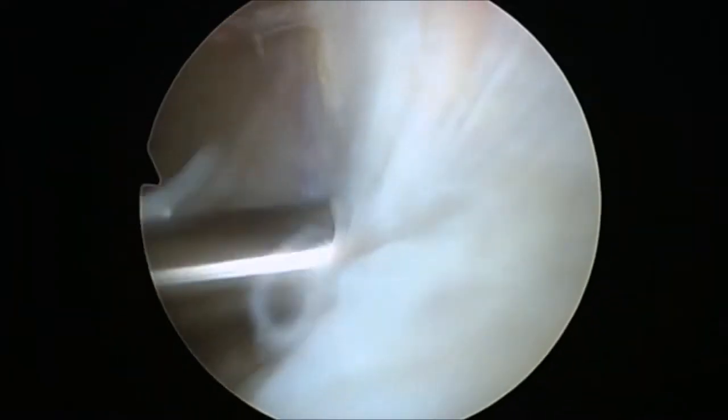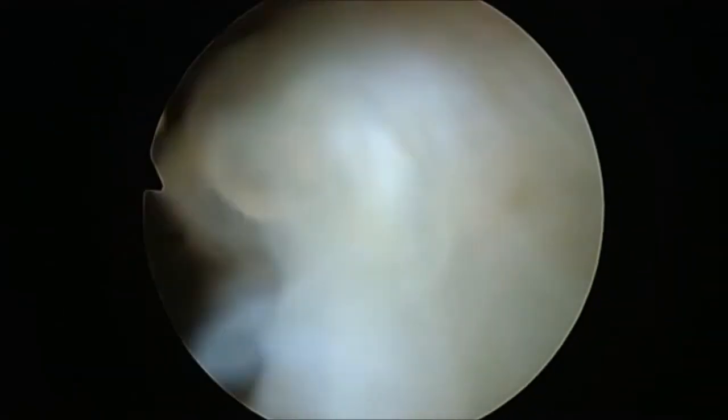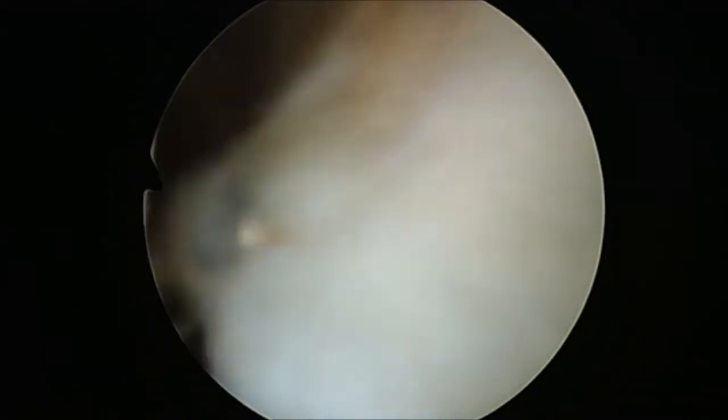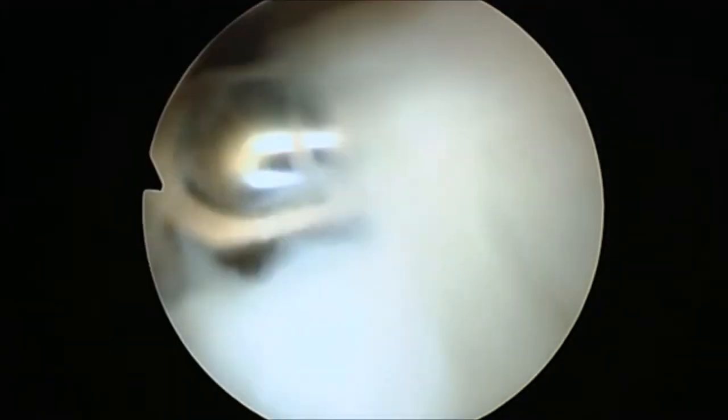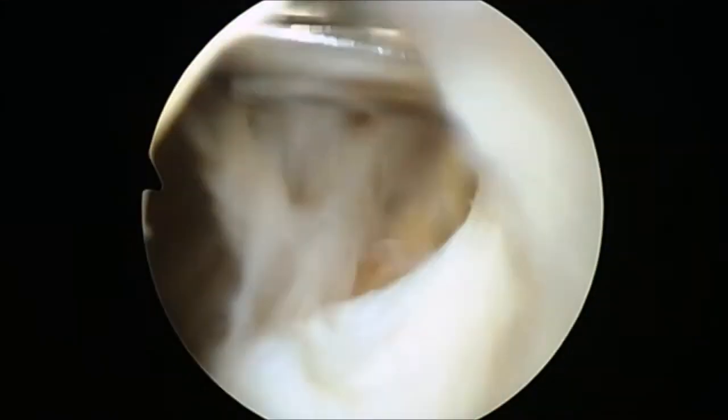During this process, it is important to maintain the blade of the shaver facing anteriorly at all times. This precaution helps to avoid any damage to the vascular structures.